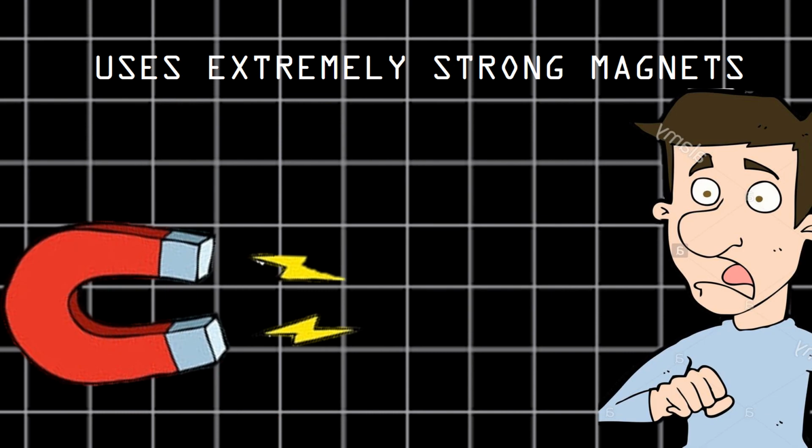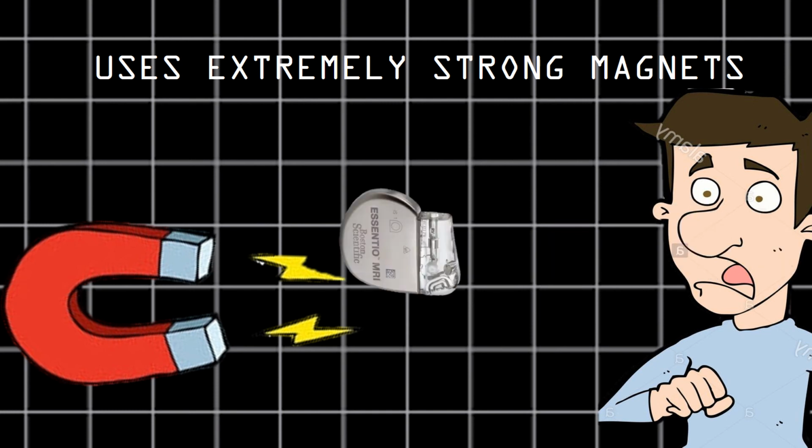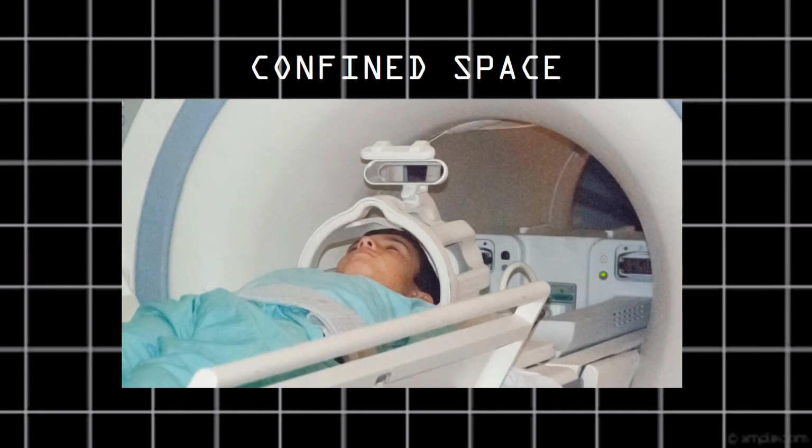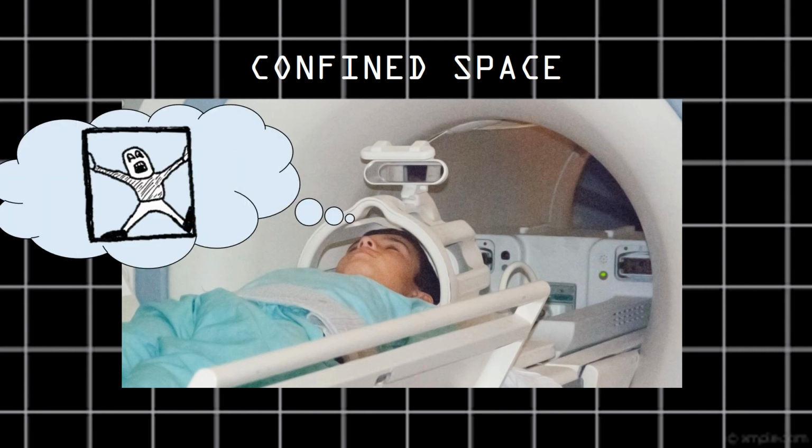MRIs also utilize large magnets to produce strong magnetic fields, which, when in range of metallic implants, may damage them or cause severe injury. This means that patients with any form of metallic implant, such as a pacemaker or a metallic knee rod, may not be able to receive treatment through the MRI. MRIs also require the patient to be in a confined and closed space for up to an hour, which may be concerning for nervous and claustrophobic patients.